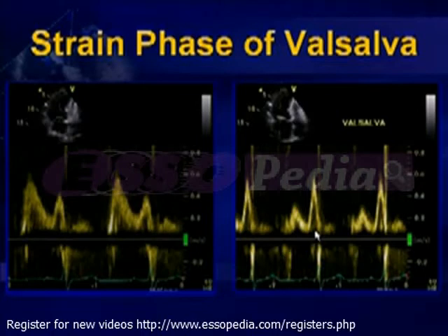A decrease of greater than or equal to 50% in the E/A ratio, with a noticeable increase in the A wave velocity and duration, as the atria are now ejecting into a ventricle with a lower pressure, can be quite specific for increased LV filling pressures.